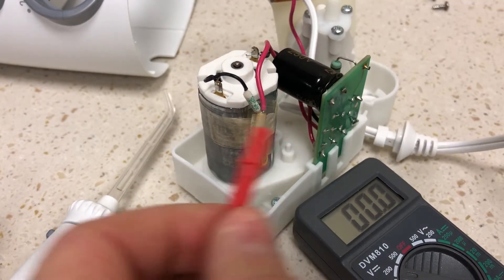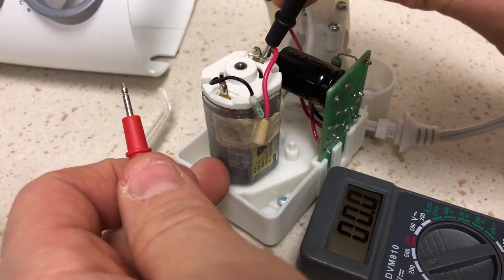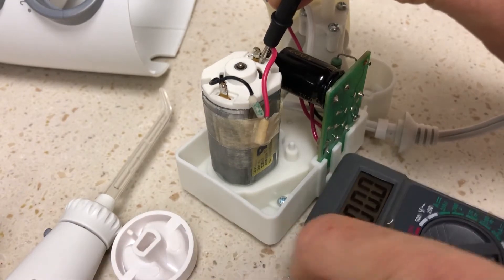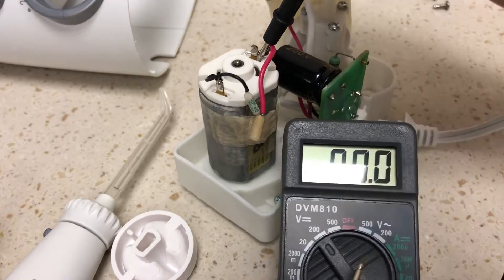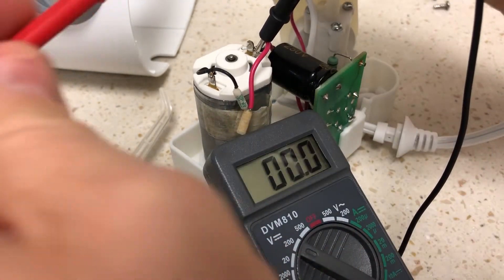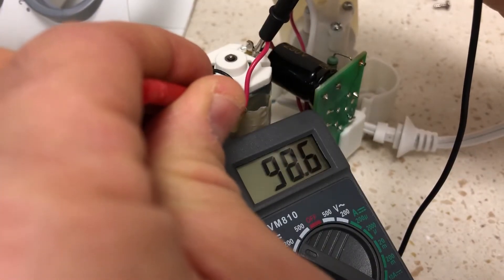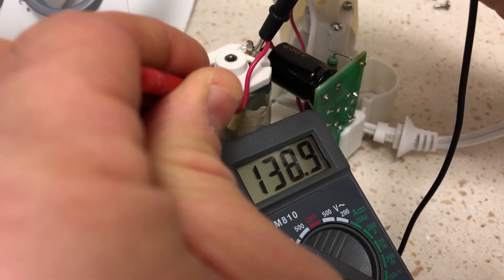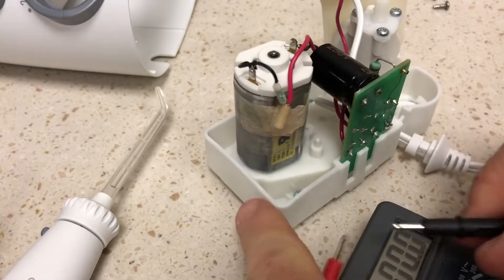If I go here to the motor and touch here, we should be able to see on this multimeter — can you see that? There's 143 volts going to the motor and dropping. You basically want to short out this cap.